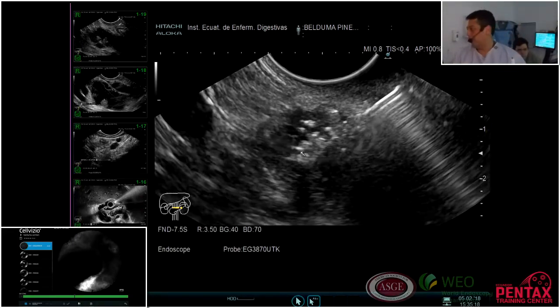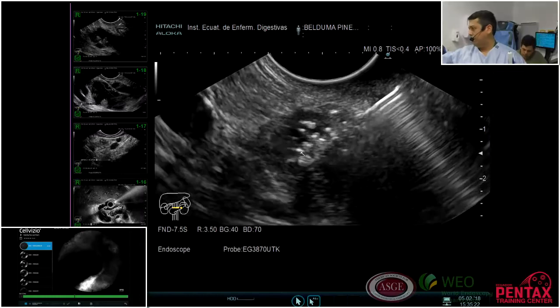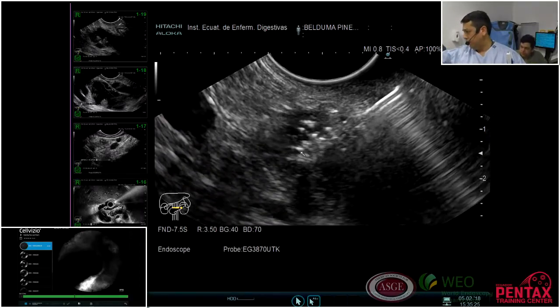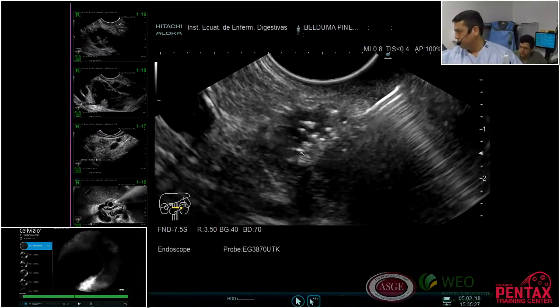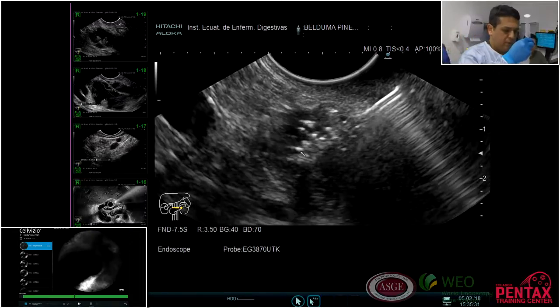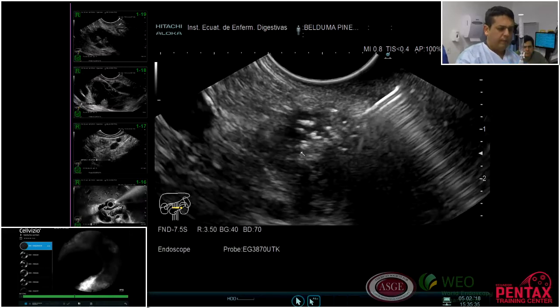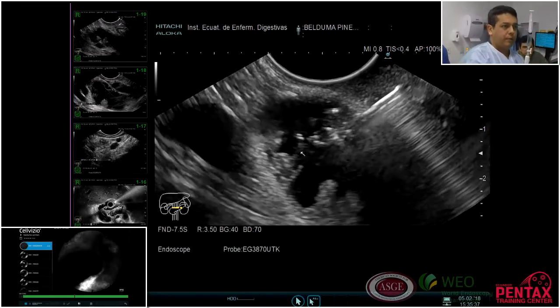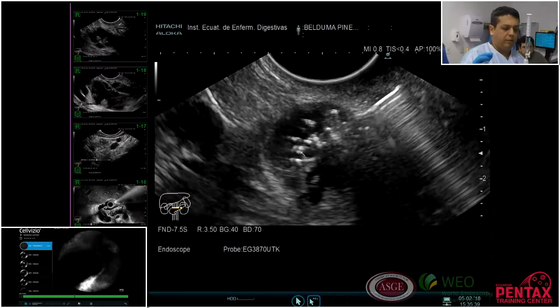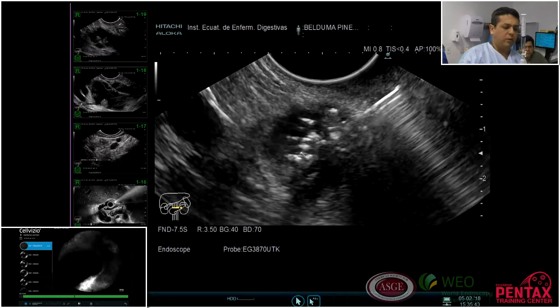I will perform an aspiration. Dame para aspirar, niña. Dame la jeringuilla. Ok, gracias. I saw the liquid, and it's not liquid.